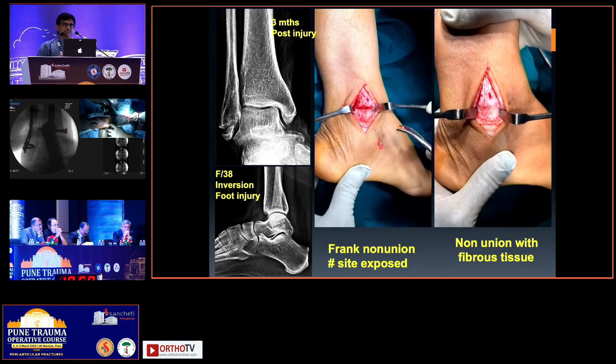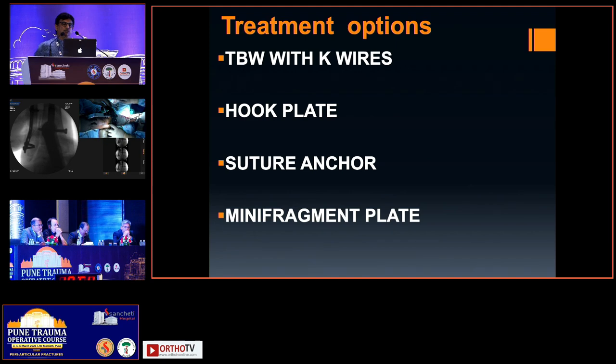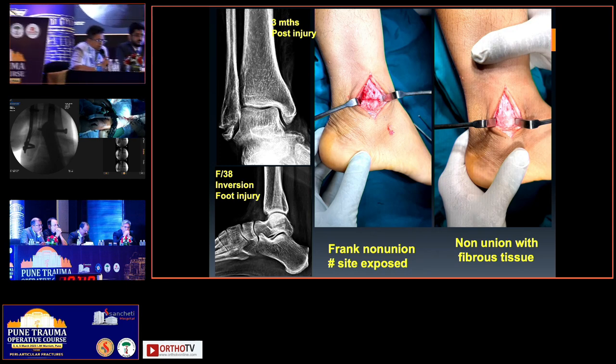Now, how to fix it? What to do? That was the thing. So, tension band with K wires. No, no, go back, Jignesh. Go back on this. So, question to Sampath.